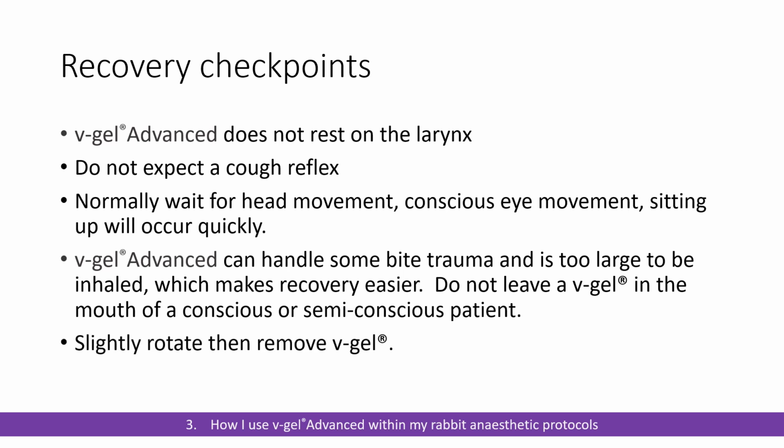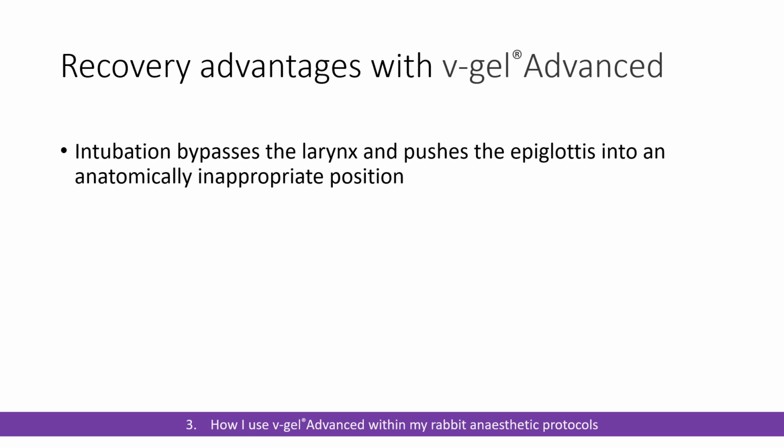Sometimes if the v-gel is very firmly placed in there, you need to rotate it slightly clockwise or anti-clockwise to unlock that seal from the pharynx and then remove it.